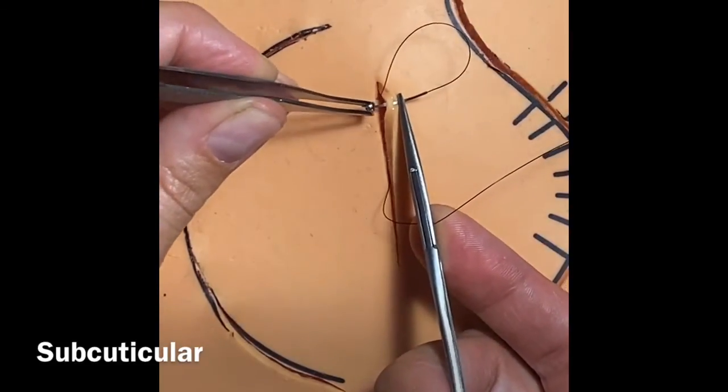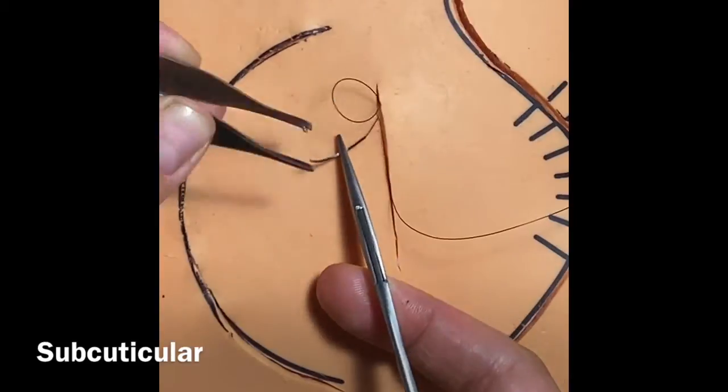That way your knot is buried right from the get-go. Don't be discouraged if your suture rips through the fake skin with this. That happens often. This adds an extra challenge.